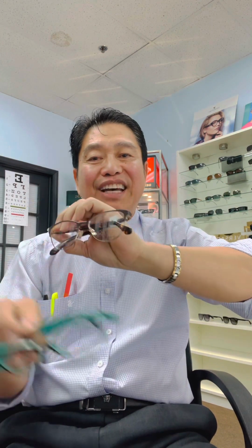Again, as I said, it comes with a lot of colors, and also it's a hypoallergenic material, so if you have an allergic reaction to metal, plastic frame is also good for you. Okay, so these are the 2 materials that we use for eyeglasses: plastic frame and metal frame. Again, metal frame can be made of stainless steel, aluminum, and titanium. Okay, our next topic is the frame design.